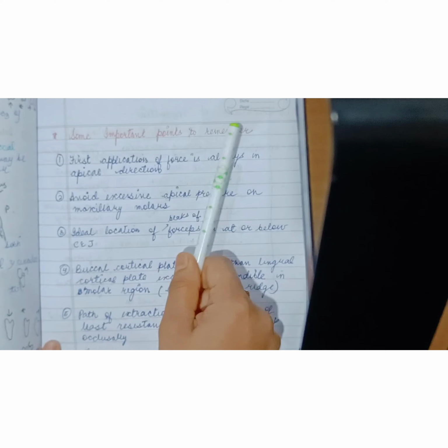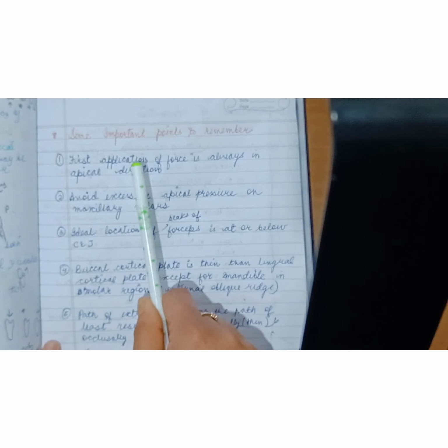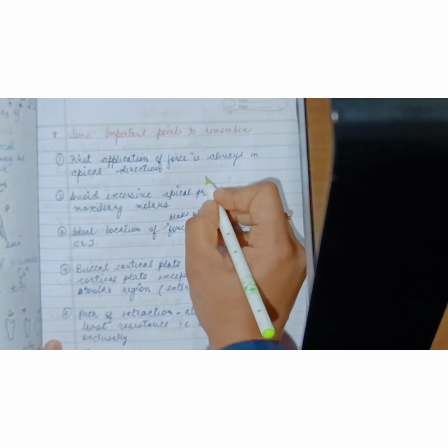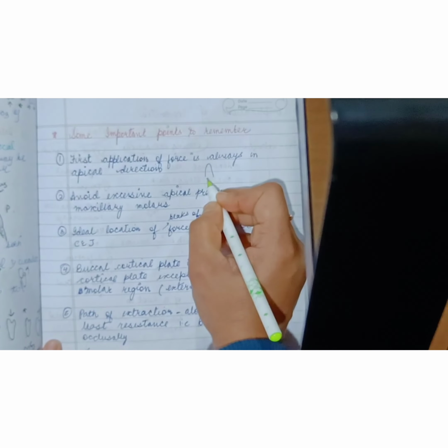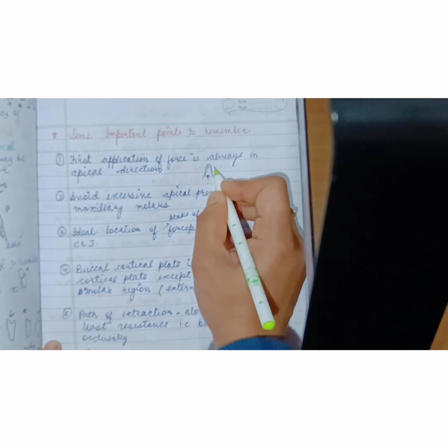Some important points to remember. First, application of the force is always in the apical direction. That is, when you attempt to extract the tooth, the first direction of the force should be in the apical direction. This is the apical direction, towards the root apex.